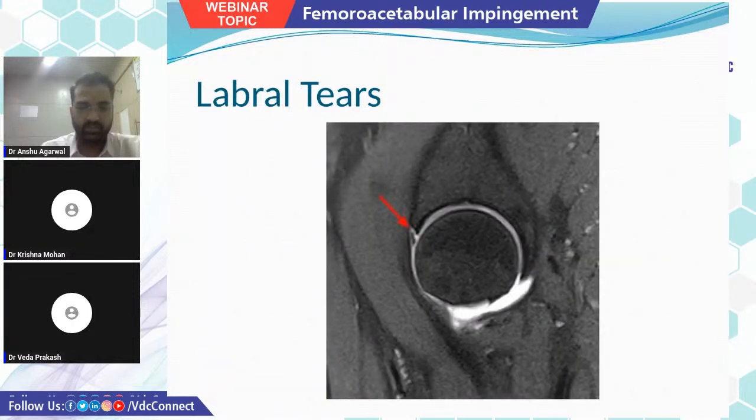Now let's see some examples of the labral tears. Now this is a 57-year-old female with right groin pain for 2 months and no relief after intra-articular steroids, and there was an arthrogram done. We can see the contrast going through the labral cartilage junction representing a tear. You can see the contrast is going through and through the labral cartilage junction, and the labrum is torn with this, and there's loss of that normal triangular pattern of the labrum. The torn part also has irregular margin.